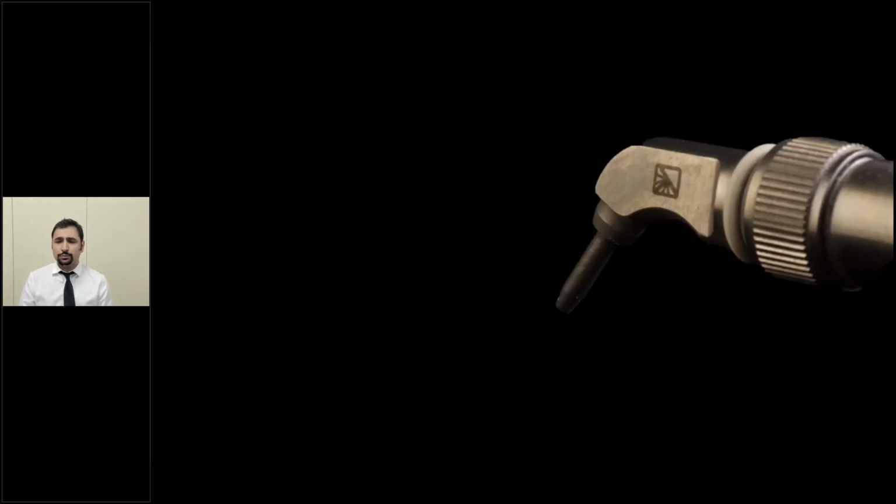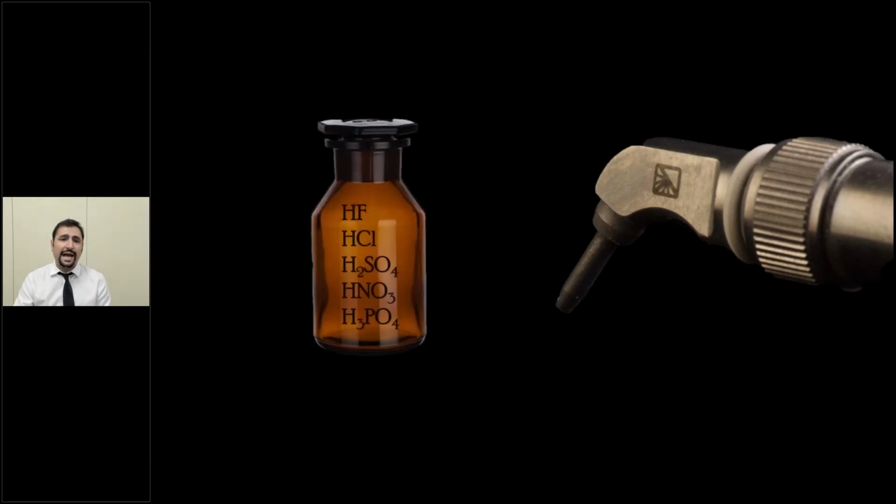Traditionally, we use aluminum oxide, alumina, in the form of particles. We air abrade, using air pressure, and we bombard the surface to create that roughness with those alumina particles. Now, there are newer versions of how we create surface roughness. Maybe you hear from here and there that there are acids available on the market that can essentially etch the zirconia surface for bonding.